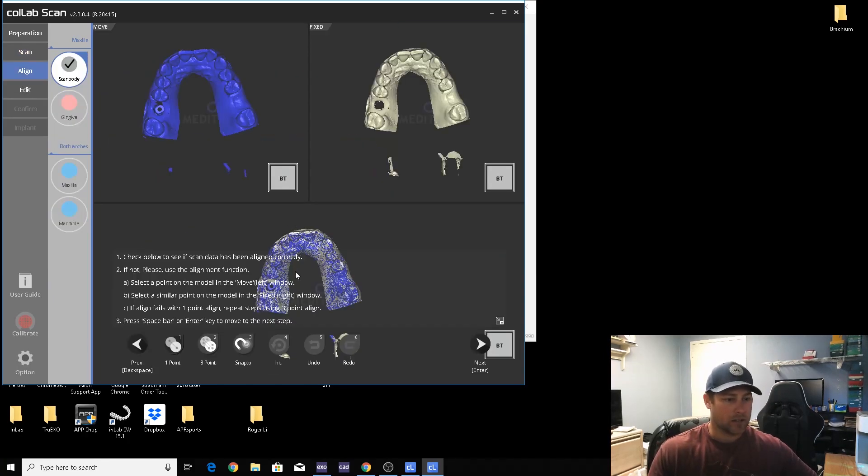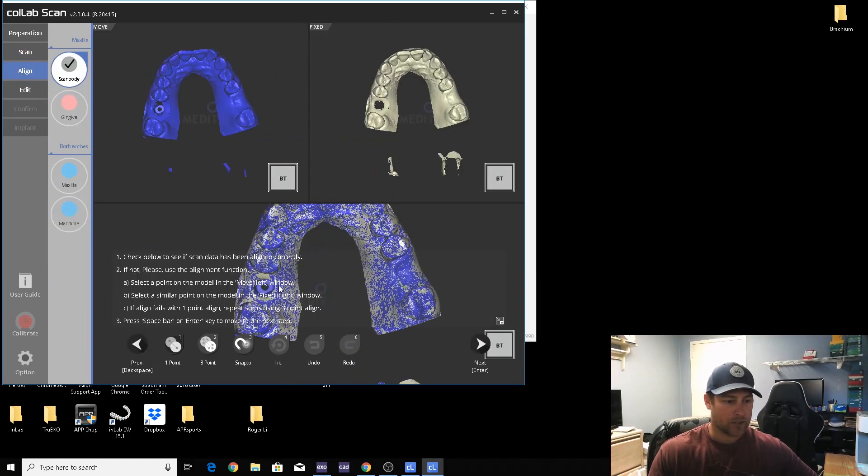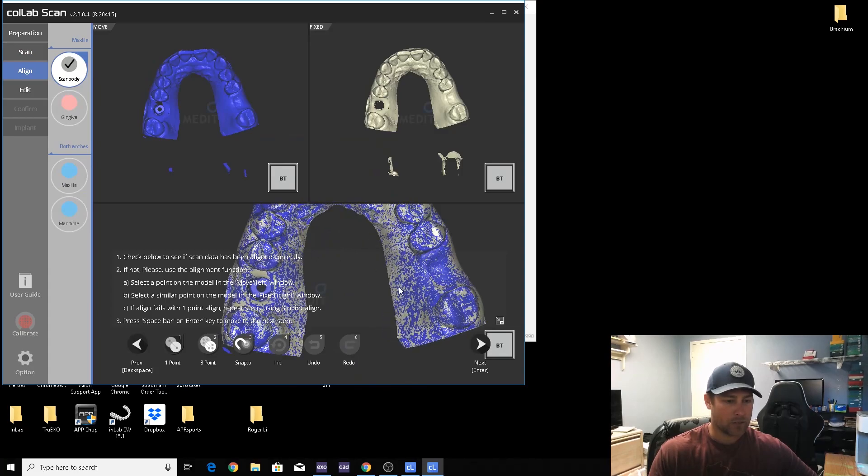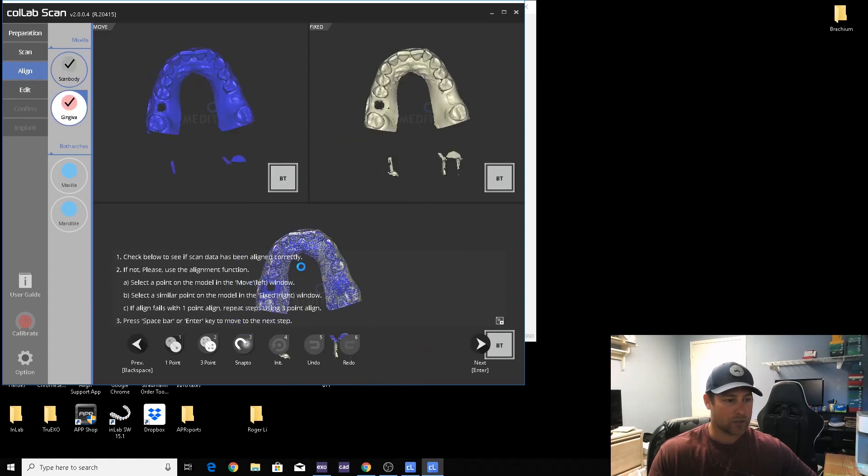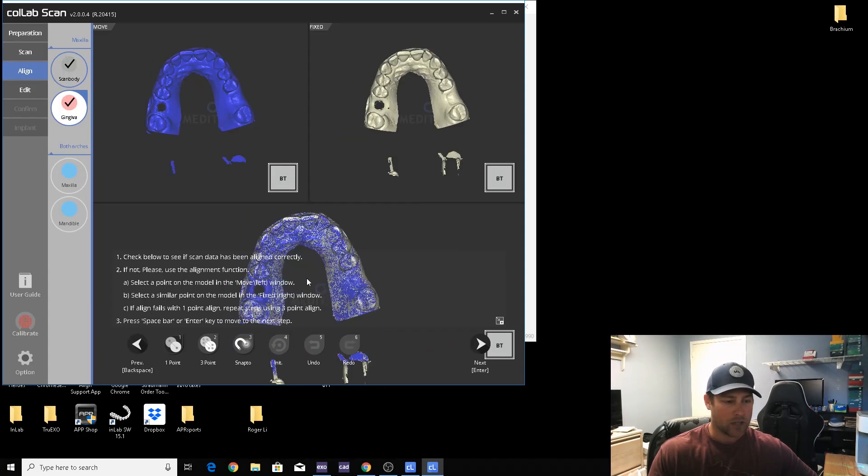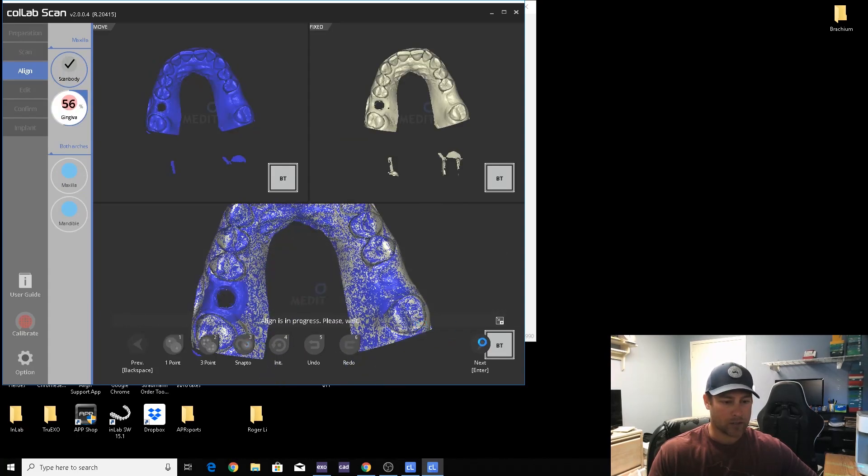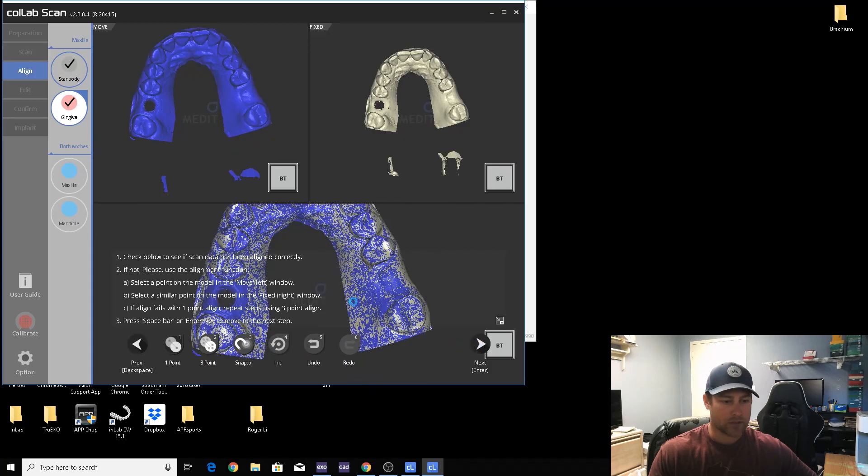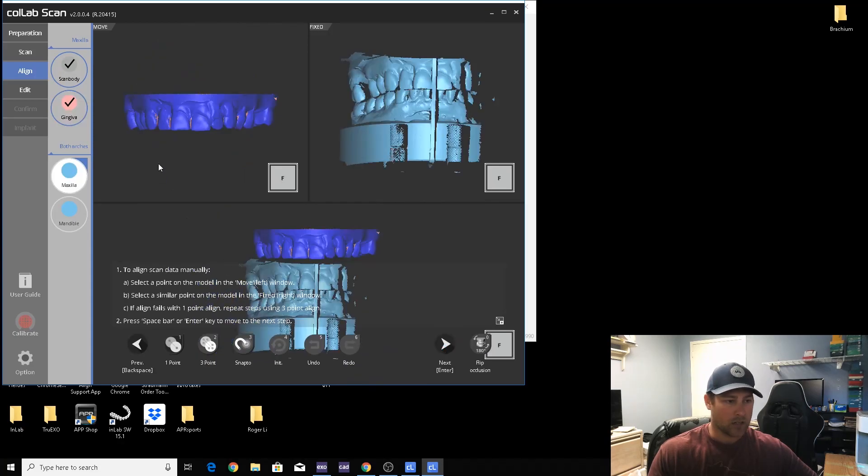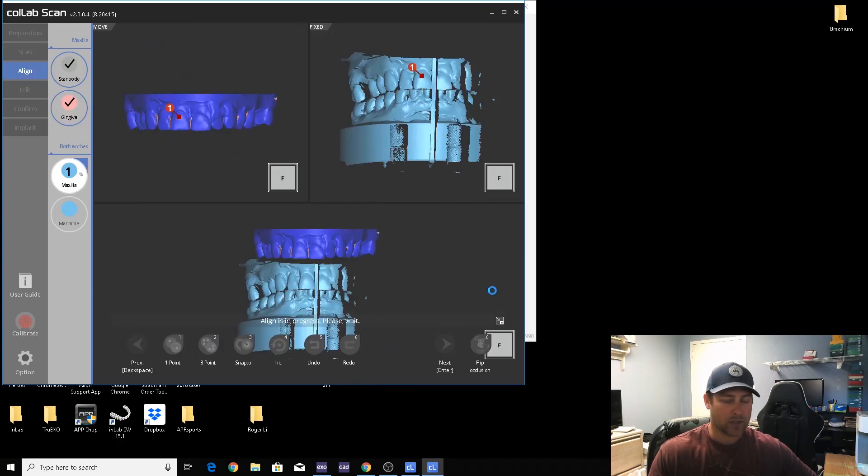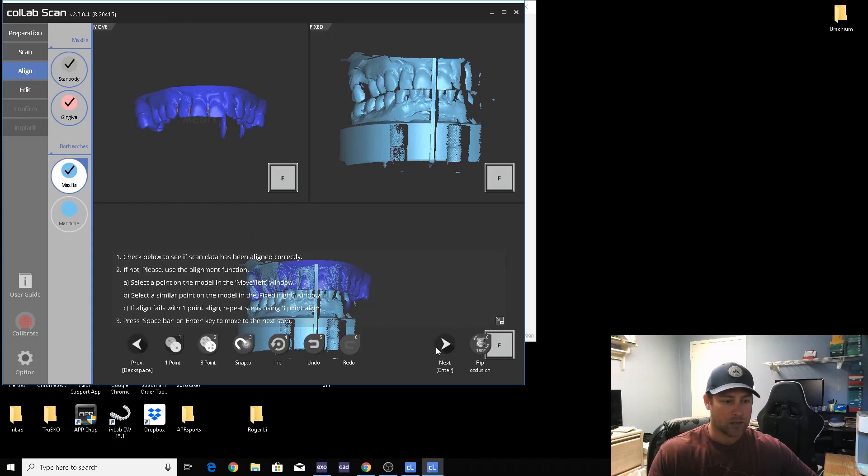Okay, we've got prep here for scan body, so that's good. Gingiva, and they usually line up automatically by themselves. Bite here, one point here, one point here, one point here. Good.